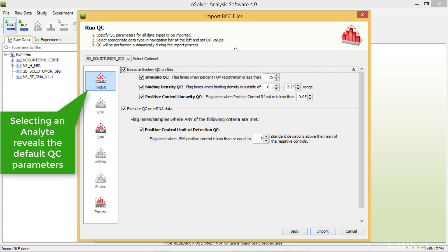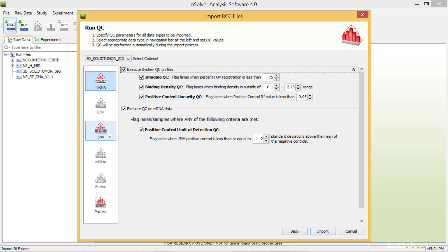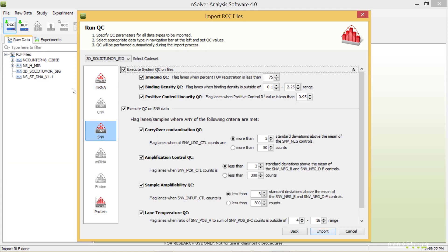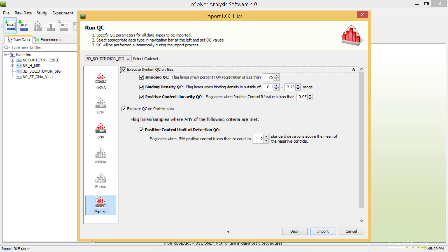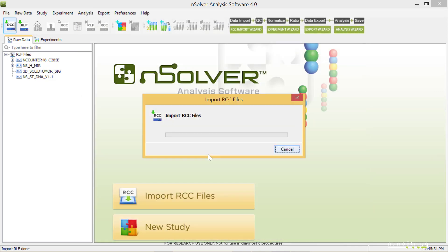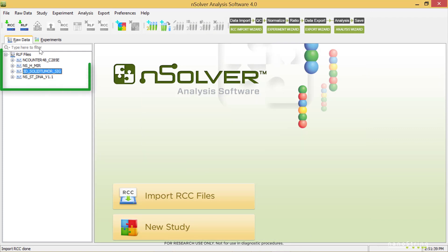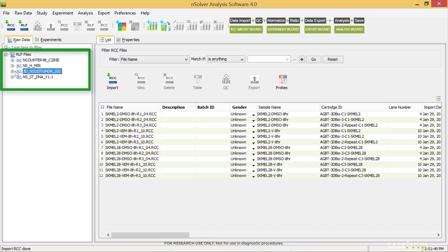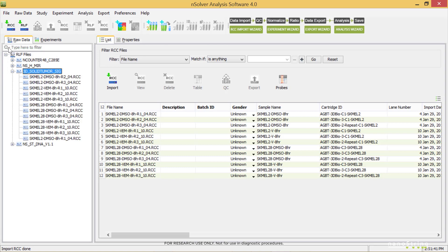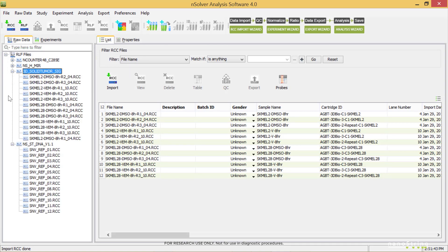Selecting an analyte reveals the default QC parameters associated with it. You may change the QC parameters, but this is not usually recommended nor necessary. Select Import. Once we've completed the import process, we can find our RCC data files under those corresponding RLF codesets on the Raw Data tab. Our samples are under 3D Solid Tumor, and SNV references are under NSSTDNA.